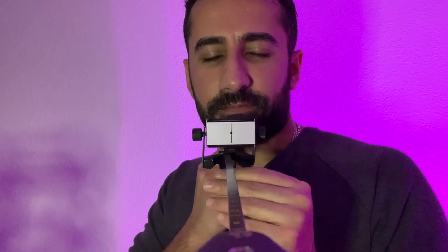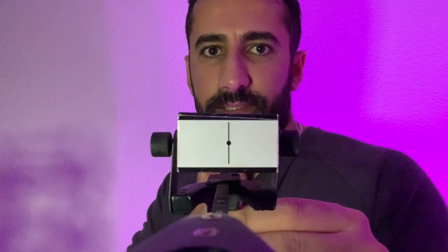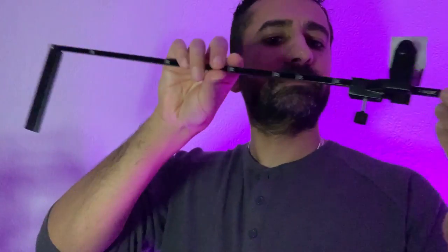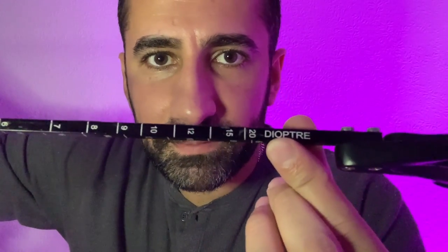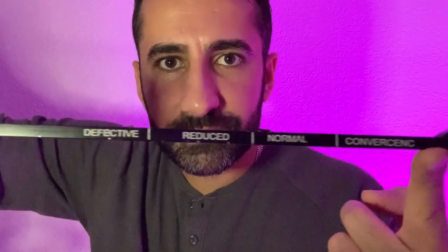Let's just say that you had double vision there — have a look at the scale. We can say that your double vision is around 15 centimeters. We also have the diopter scale for checking your amplitude of accommodation — your focusing power in diopters. There is a part here that tells us what is normal or reduced. So that is the RAF rule.